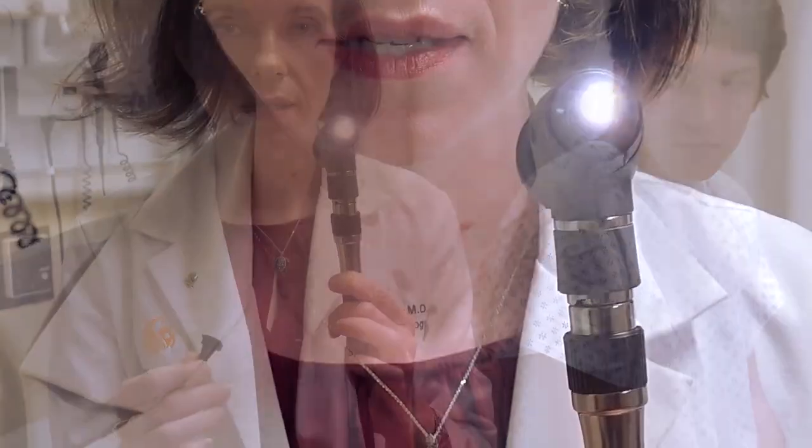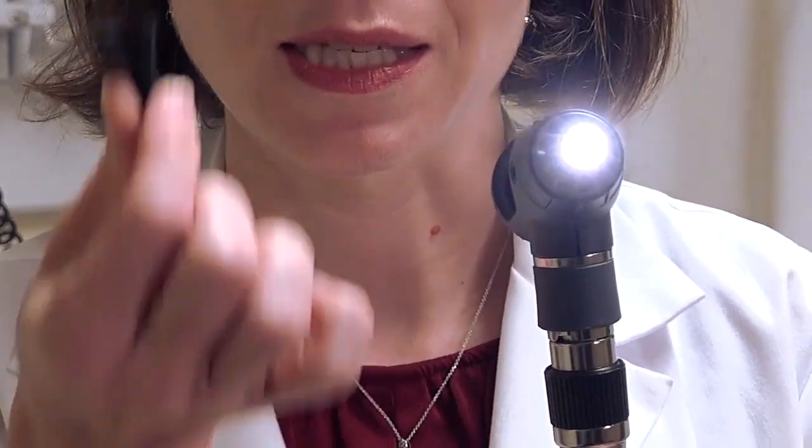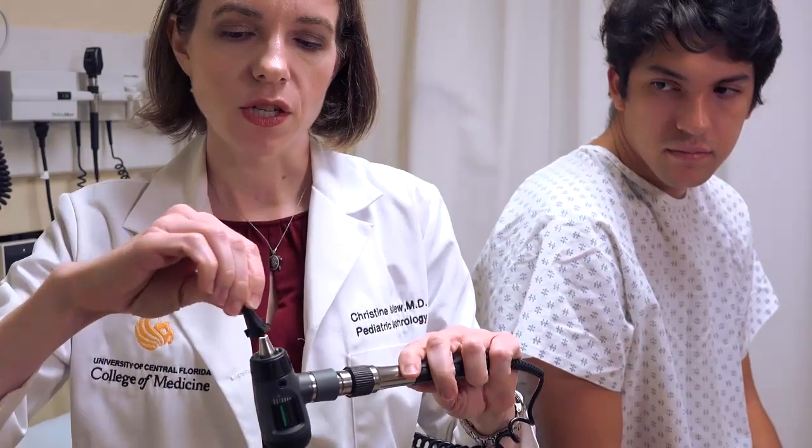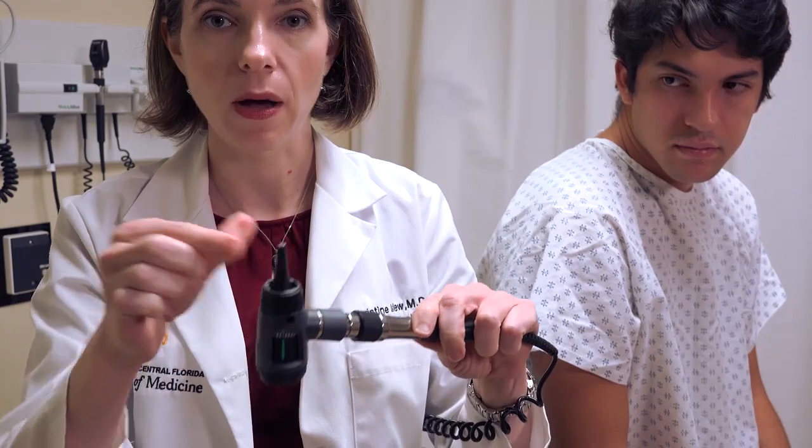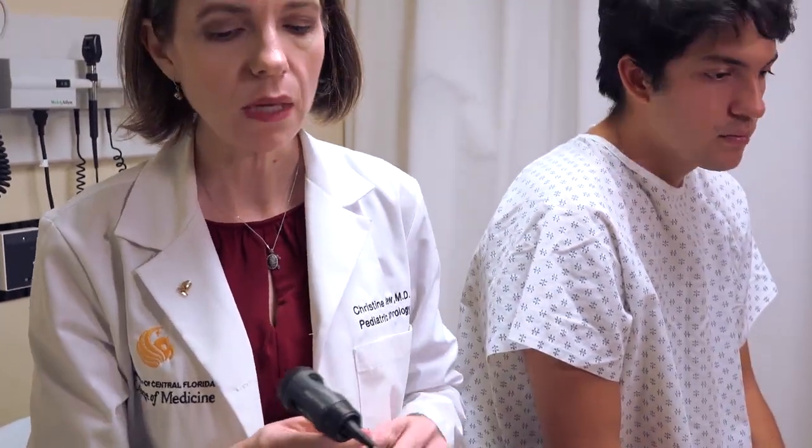To put the speculum on, there are notches on the front of the otoscope that the speculum fits into. Slip the speculum in and twist so that it locks into place. When you pull up on it, it's stable, and when you turn it upside down, it doesn't fall out — so it's securely in place for the patient.